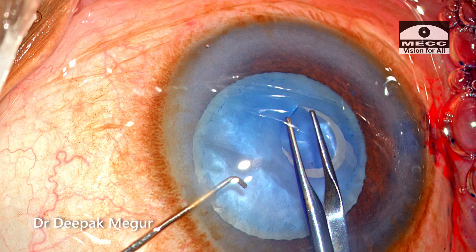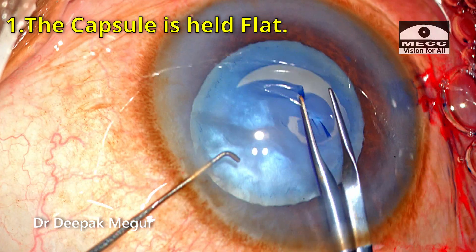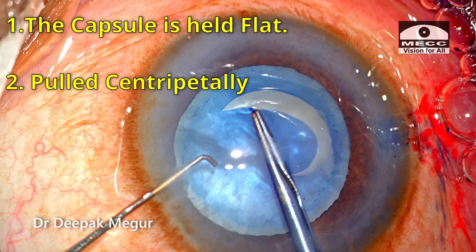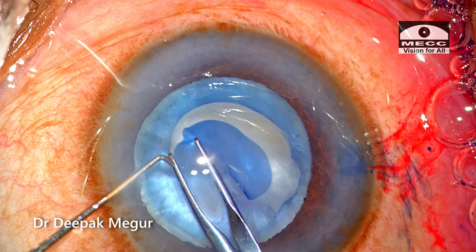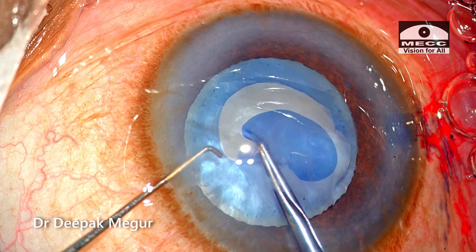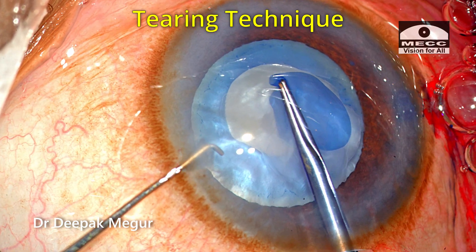When trying to enlarge the tear, I keep the capsule flat and pull it momentarily to get control. Although it doesn't seem very much in control, you can see that the capsule is prevented from running away. This is completed using the same tearing technique.